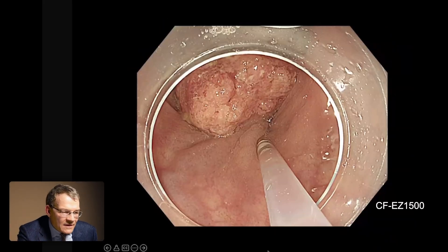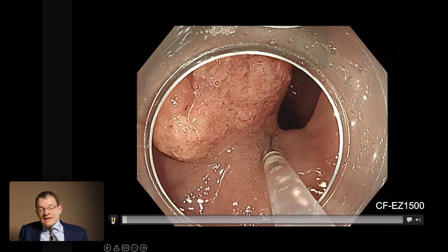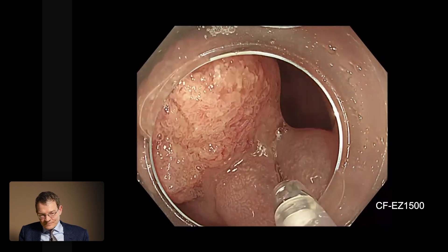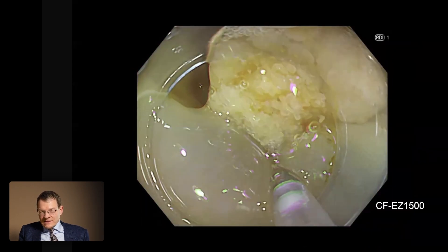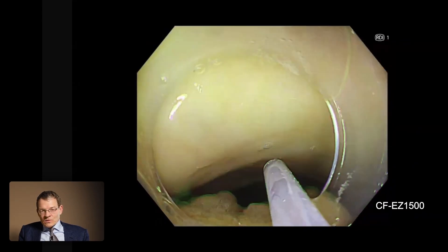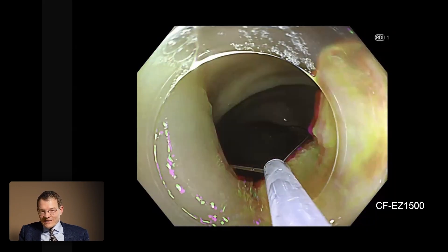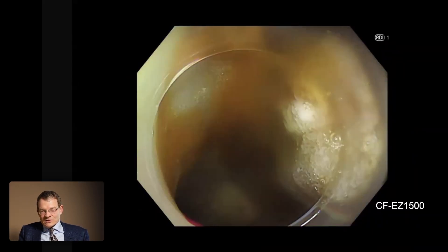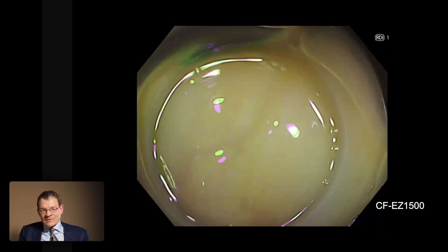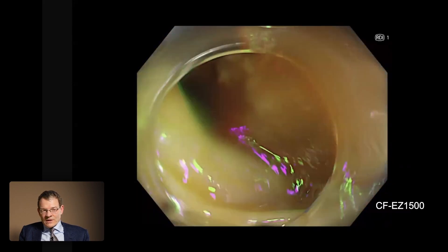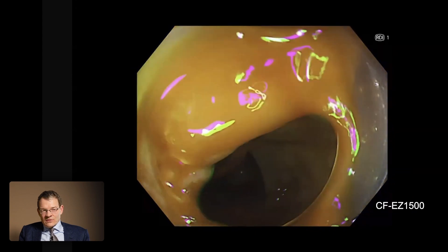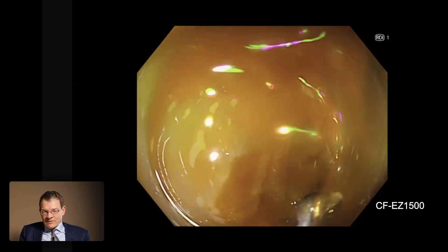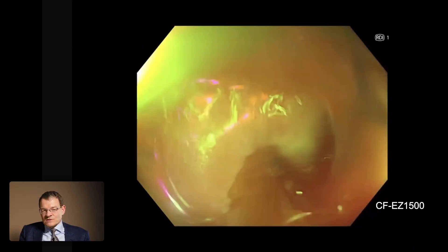This is another example — a very special malignant polyp. We decided to resect it because the polyp still had good lifting, but in such a situation we already expect heavy bleeding after the polypectomy. So I switched immediately to the RDI filter in expectation of bleeding. After the resection it definitely started to bleed. Also using the cap and carefully retracting the endoscope, you can nicely appreciate on the left side a huge arterial vessel heavily bleeding. It's a nice example that you can manage this situation easily by using RDI.